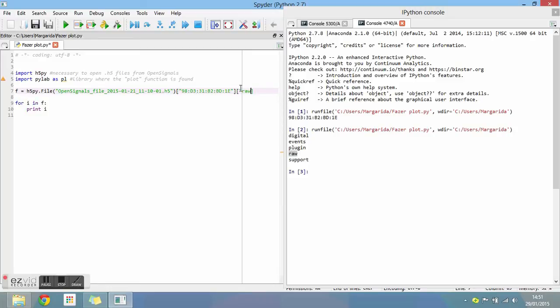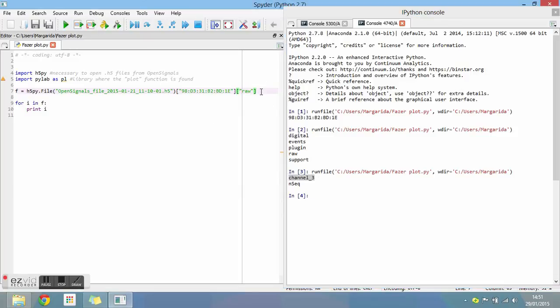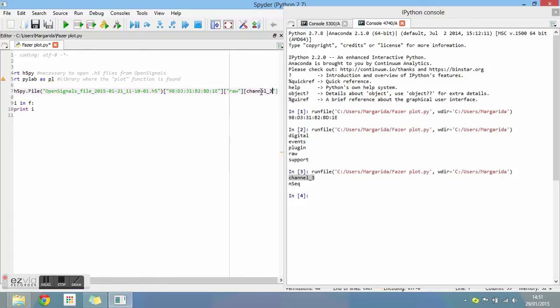When you run the program again, a list of the active channels of your file is printed. We chose an ECG file to do this tutorial, so there is only one channel active.